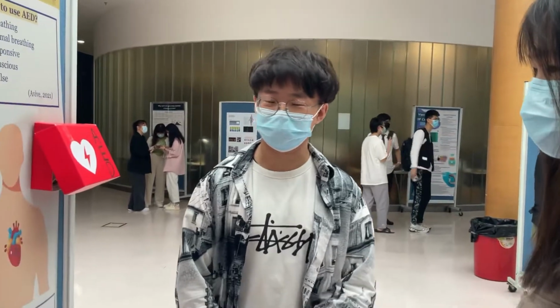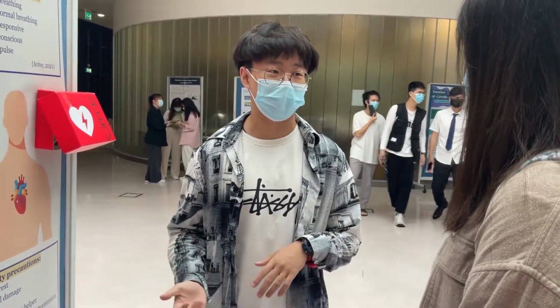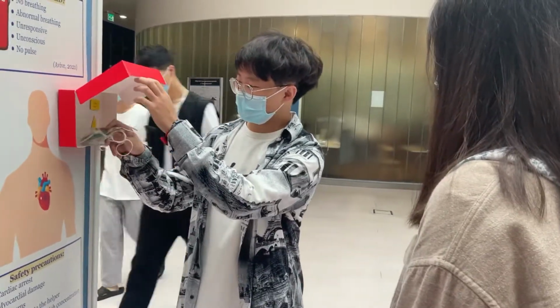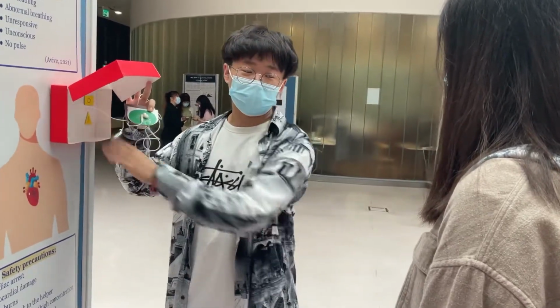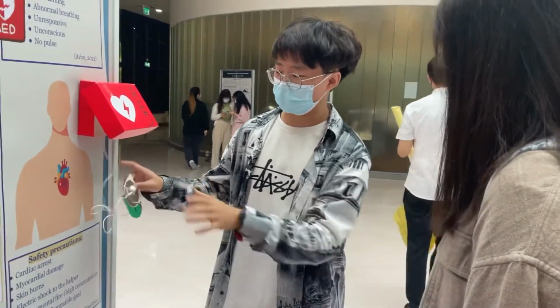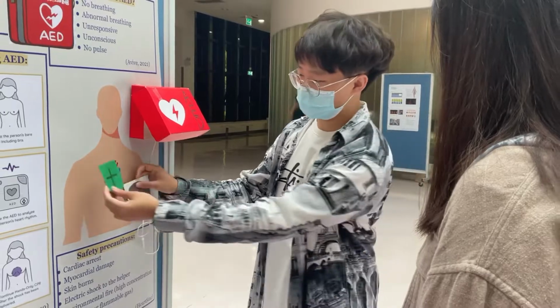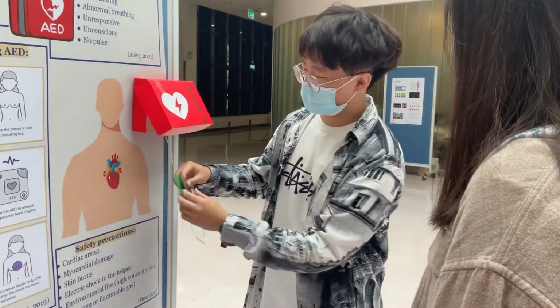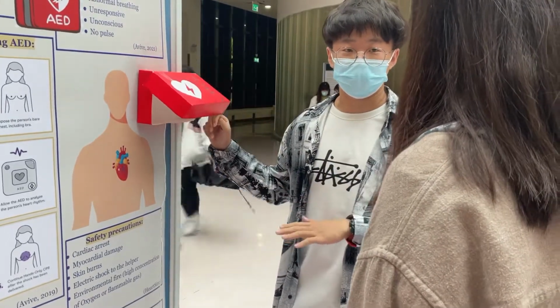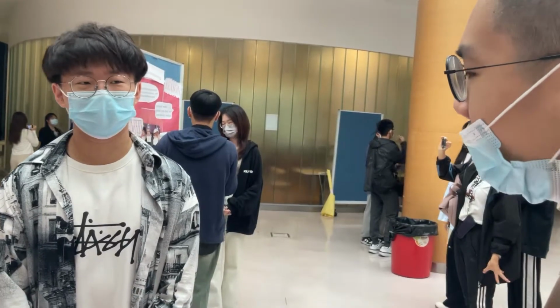This is very easy to use by non-professional people or people who haven't had any training. The first step is to open the box and push the power button, and the AED will tell you what to do next. And next is to take off the clothes of the patient and apply the two electrodes to the patient like this. And next is to push the shocking button, and the AED will give the shock to the patient. Which we should pay attention to, to avoid danger.